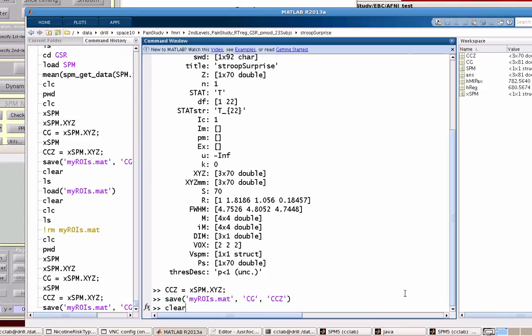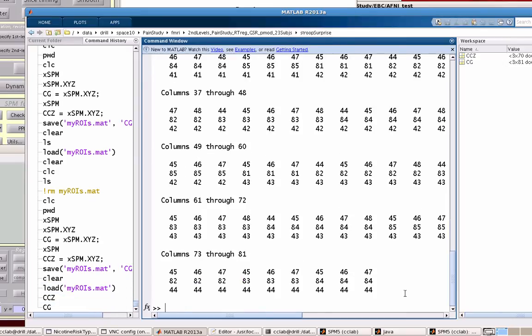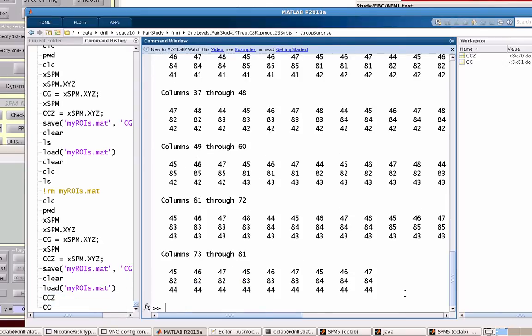So now if I cleared everything, I can just load up my ROIs and get those coordinates back.